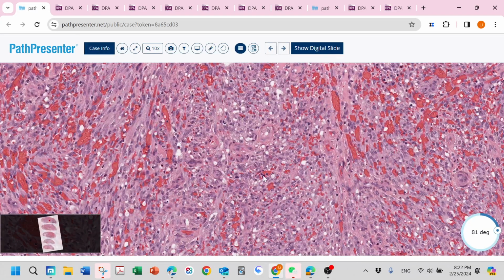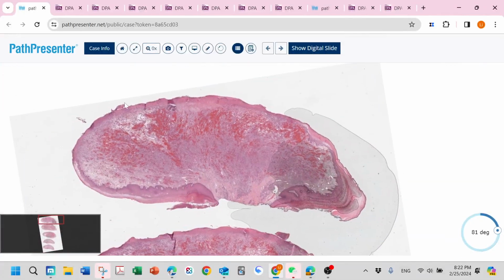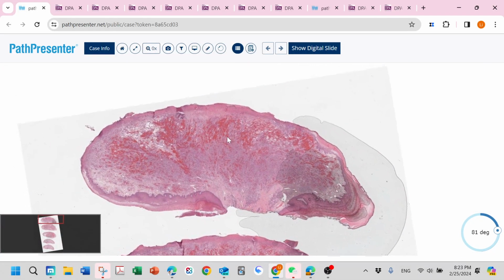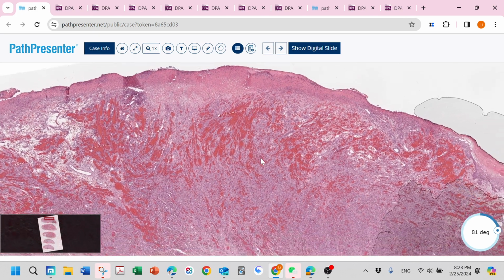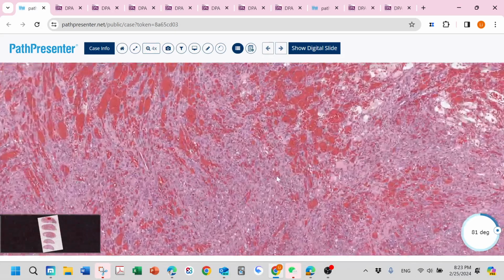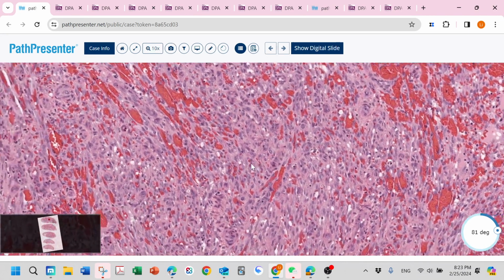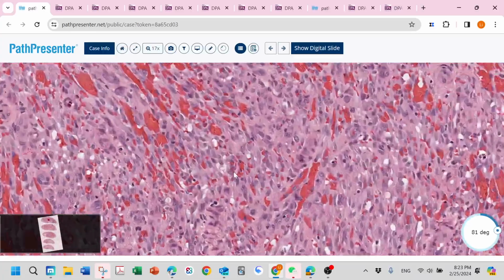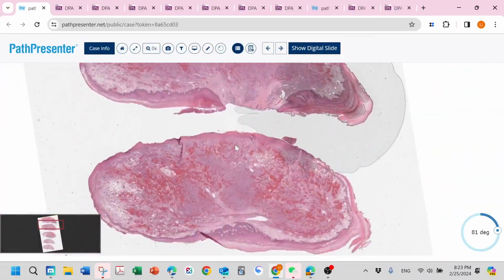Sometimes you can see inflammatory cells because, as you can see, this nodule has an ulcerated surface. Every time, under an ulcer, you may see reactive inflammatory cells. That is normal. So please do not let this lesion trick you into thinking it's just reactive when you see these tons of proliferative spindle cells with slit-like structures. So this is nodular or tumor stage Kaposi sarcoma.